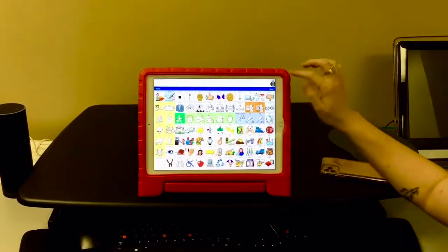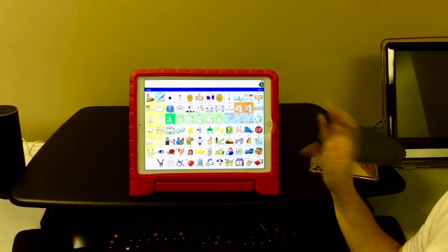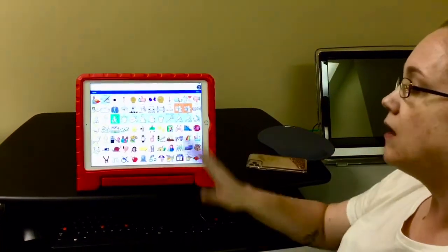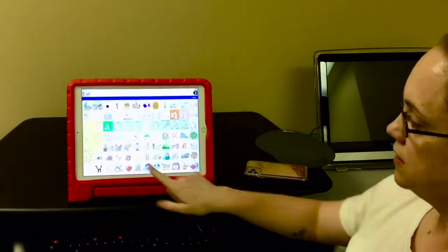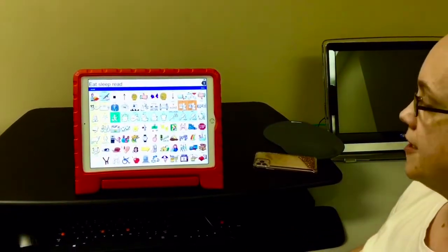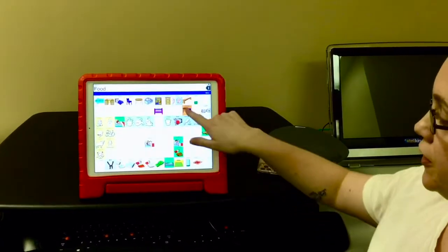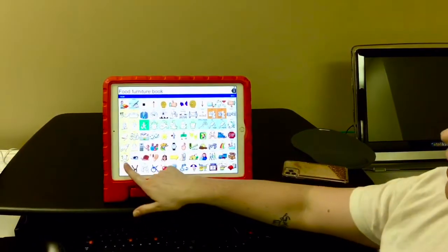So I mentioned that this is based on motor planning. So the basis for LAMP is that the core words never move. Like this little green man that says R, he's always going to be the main verb. So if I want to eat, if I want to sleep, if I wanted to read. Nouns are going to be up here in the orange. So again, food, furniture, book.